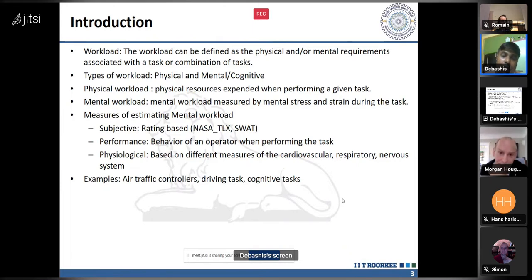That is one drawback. So apart from this, one is the structural connectivity, and the second one is how to combine cognitive modeling with the EEG. Although I don't read too much, there are millions of cognitive models, and whatever I have read so far, the basics of cognitive models, like ACT-R, I checked some papers where they find the dipoles from the ICA components, the important independent components, and from the dipoles they try to identify the different modules of ACT-R.